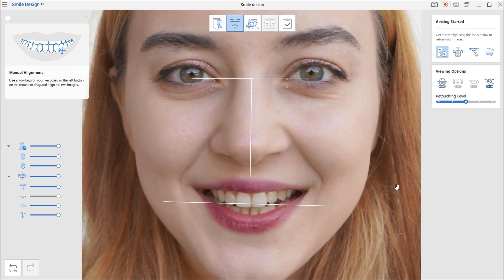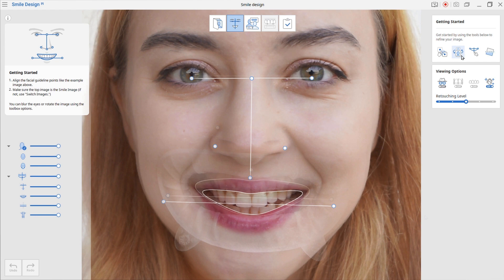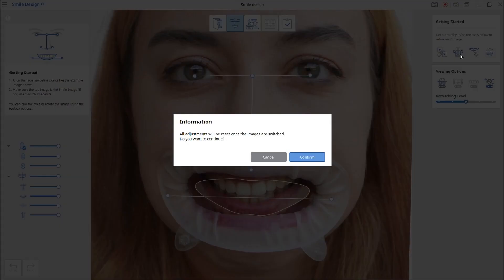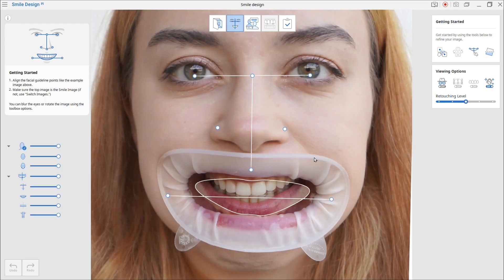Next is the Switch Images feature. Use this when the order of the smile image and retracted mouth image is switched. In Getting Started, the guidelines must be set based on the smile image. If the retracted mouth image is at the top, use Switch Images to switch the order.